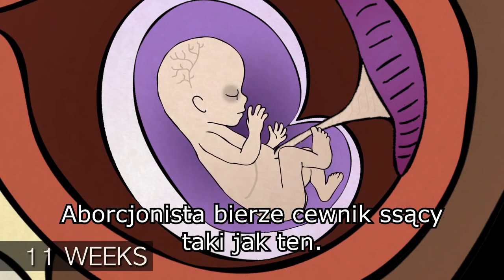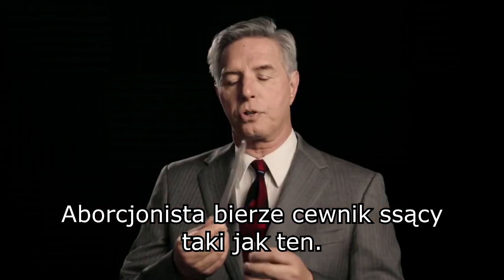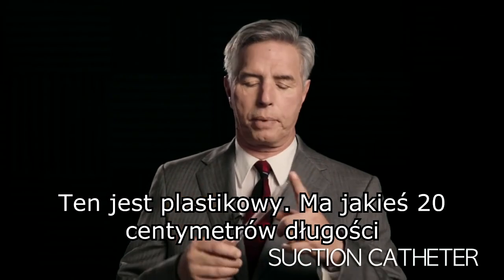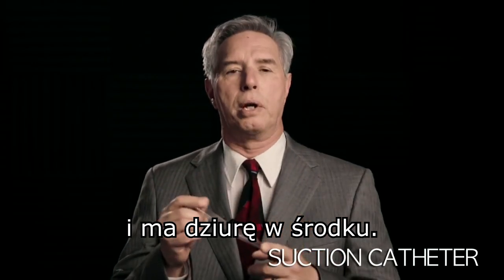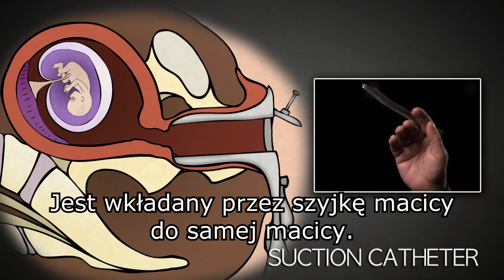The abortionist takes a suction catheter like this one. This is a 14 French suction catheter. It's clear plastic, about nine inches long, and it has a hole through the center. It is inserted through the cervix into the uterus.